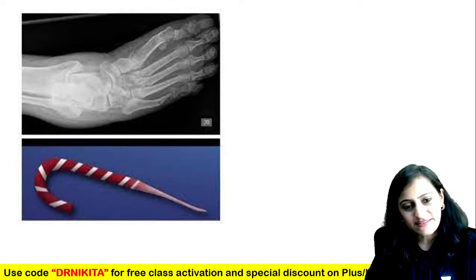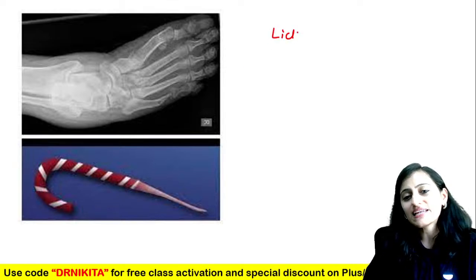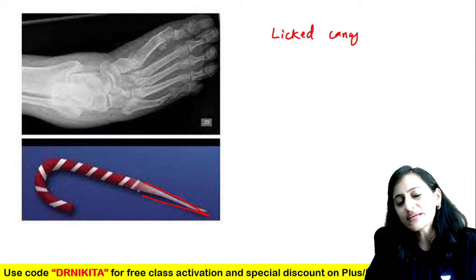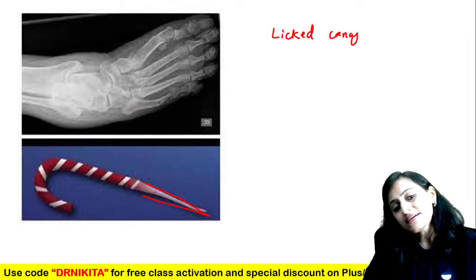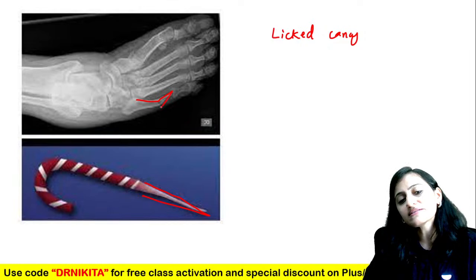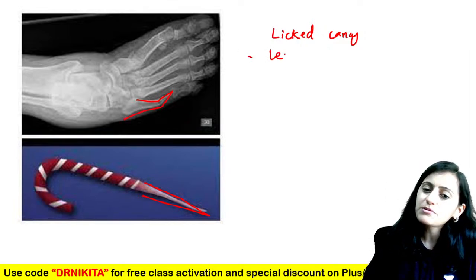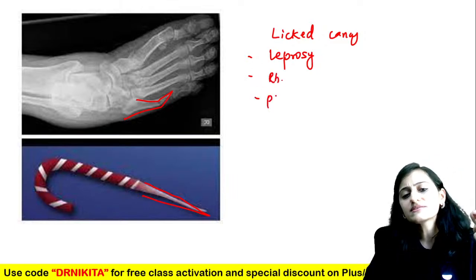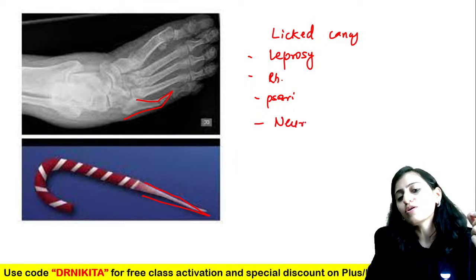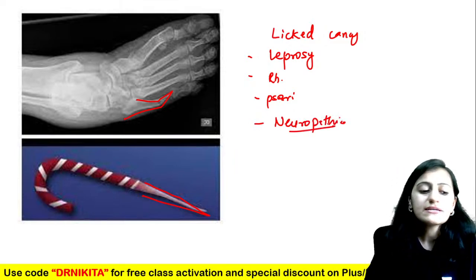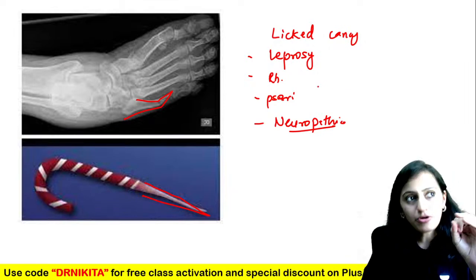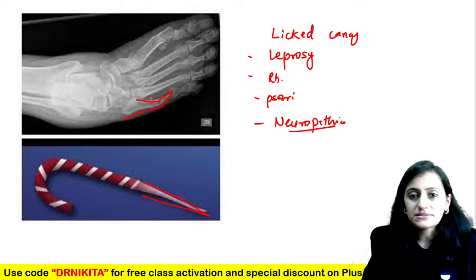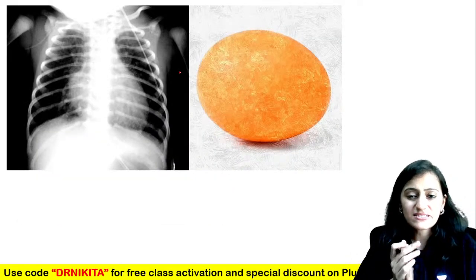This is the licked candy appearance — the pointed end that we get with the licked candy. Look at this metatarsal bone showing this pointed appearance. Licked candy appearance is commonly seen with leprosy, and also with rheumatoid arthritis, psoriatic arthritis, and the Charcot joint — the neuropathic joint.